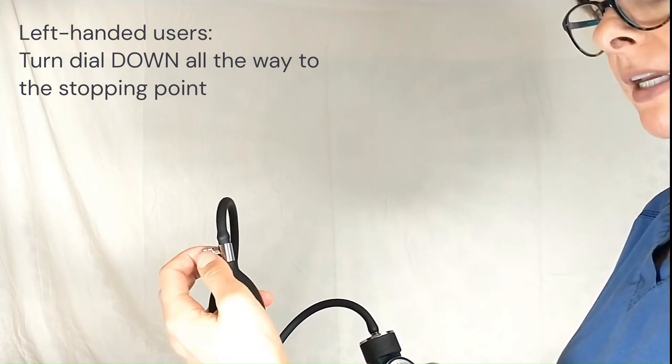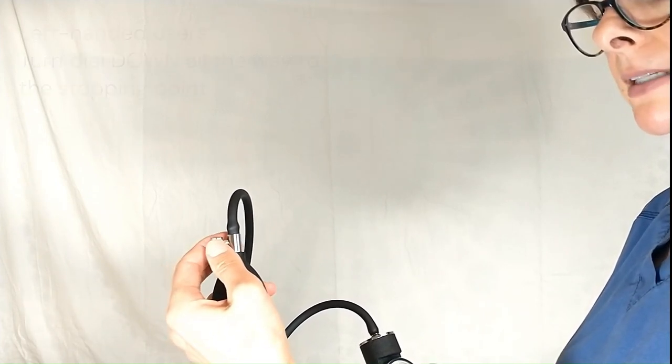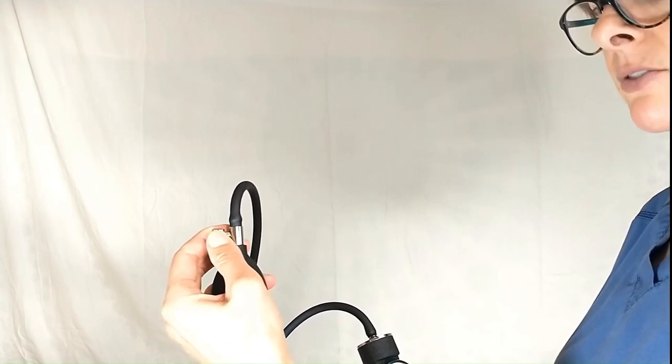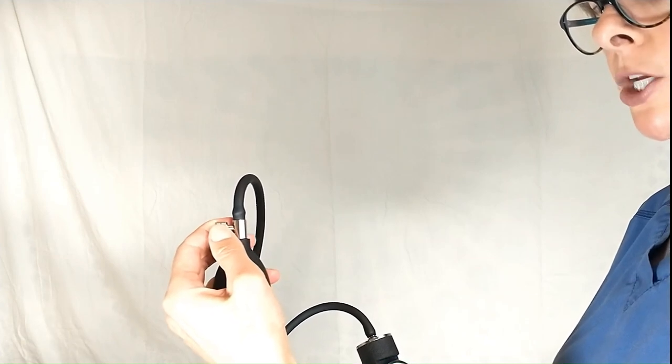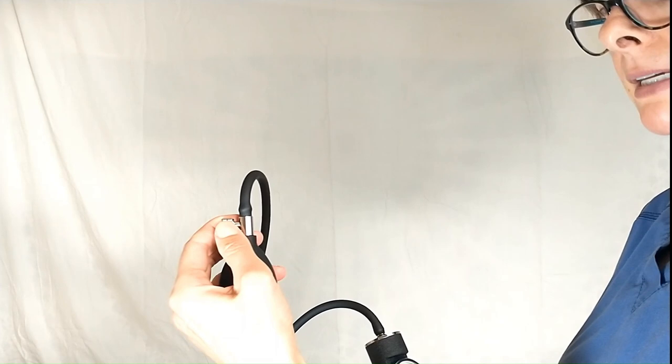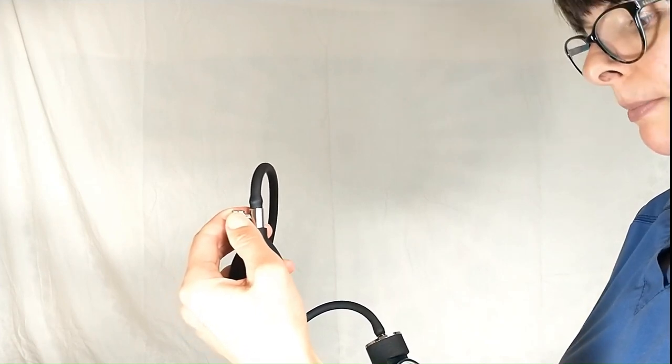And then again, you hold it with the index finger and the thumb, and in this case you will move it away from you to deflate it. It's very small movements here to make sure that the needle actually deflates at a rate that we can easily see the patient's blood pressure.